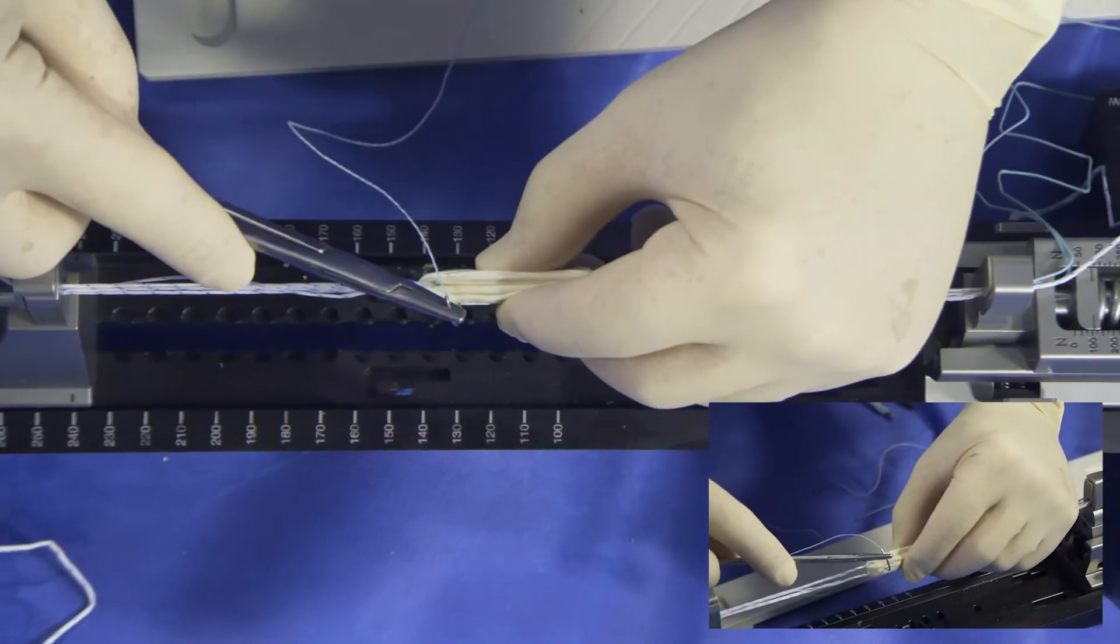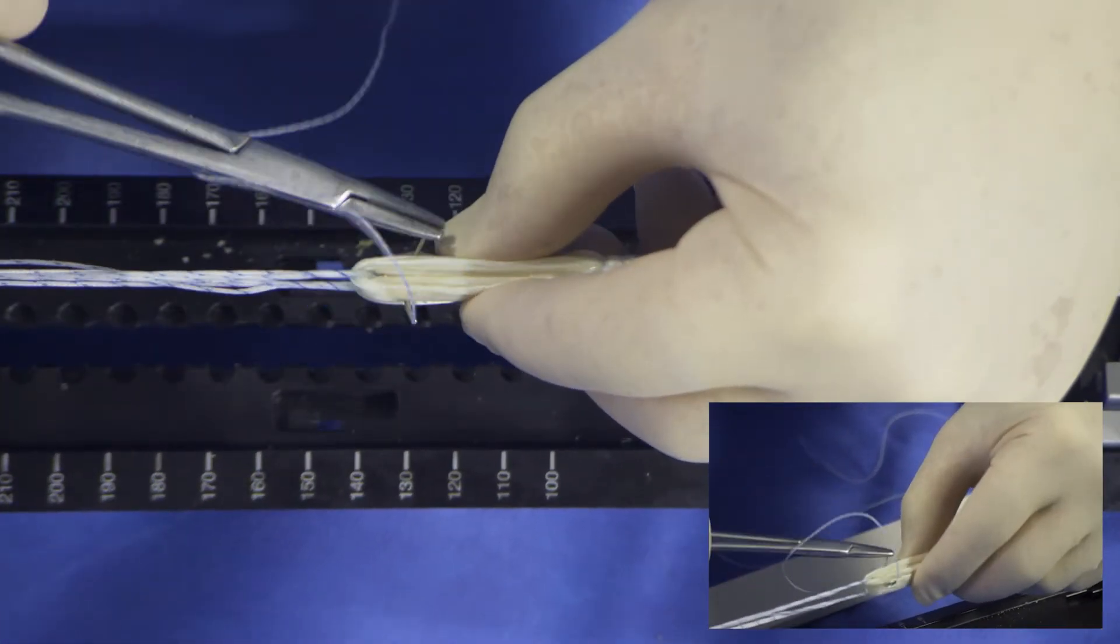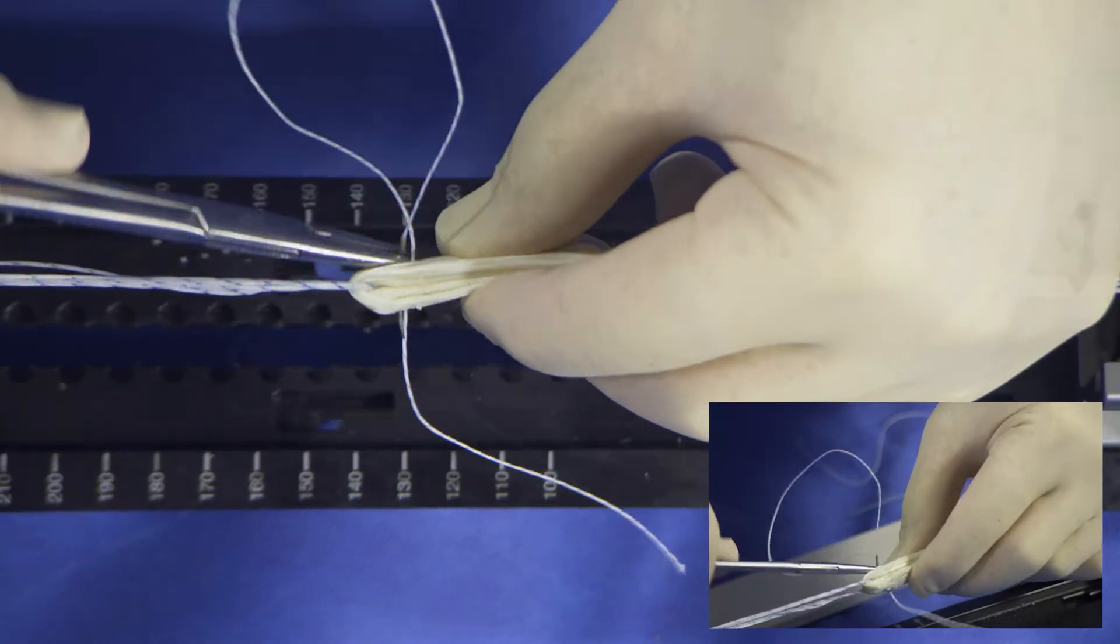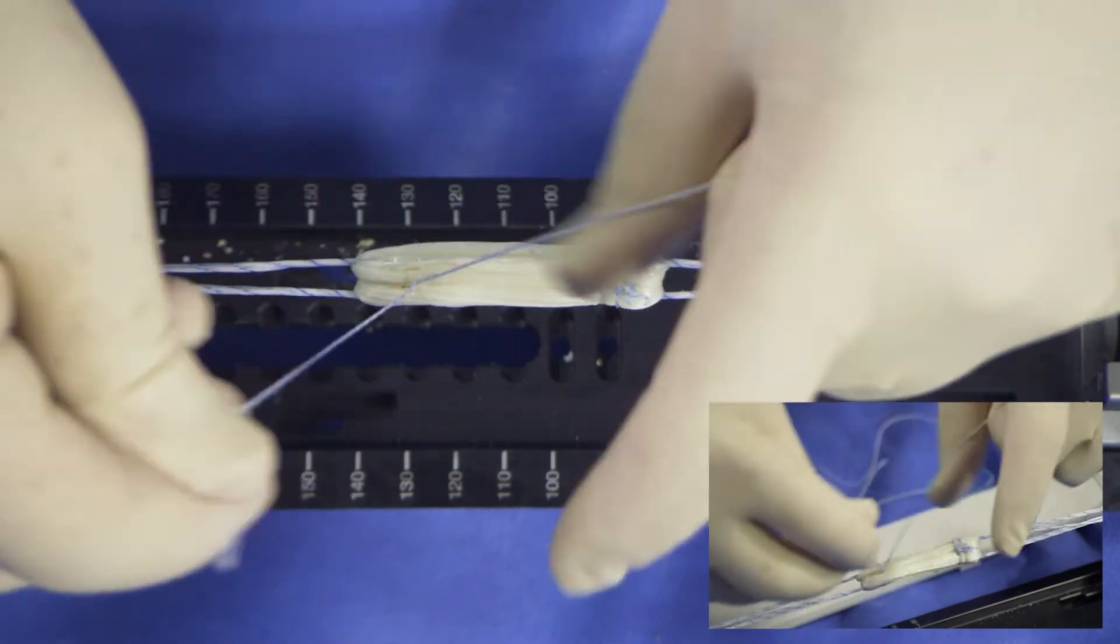A similar single suture is used on the closed end of the graft, both to package the graft and to mark 10 to 15 millimeters that will go into the femur.